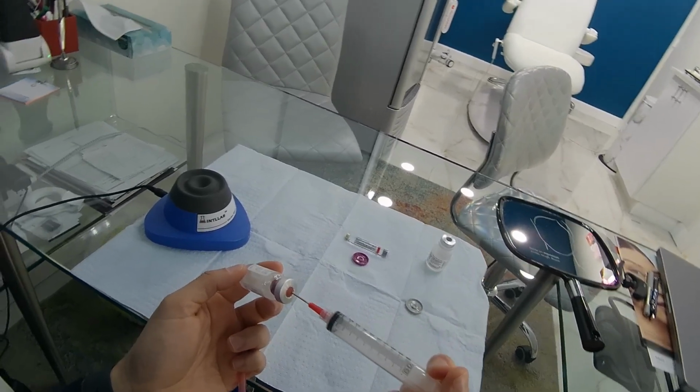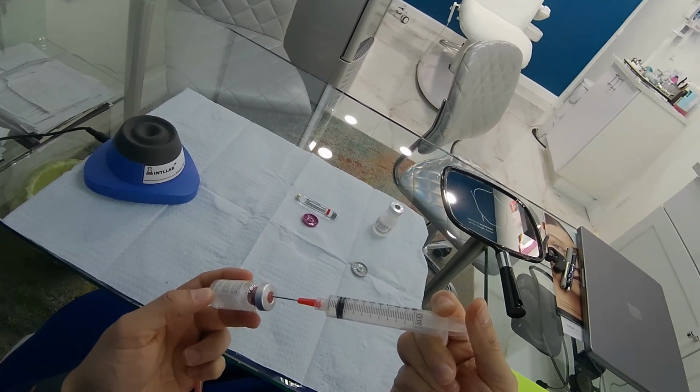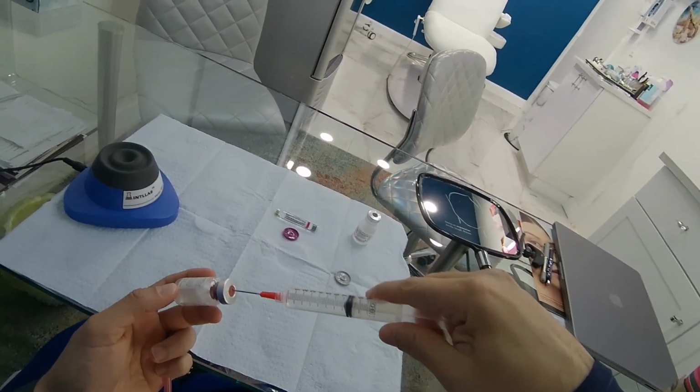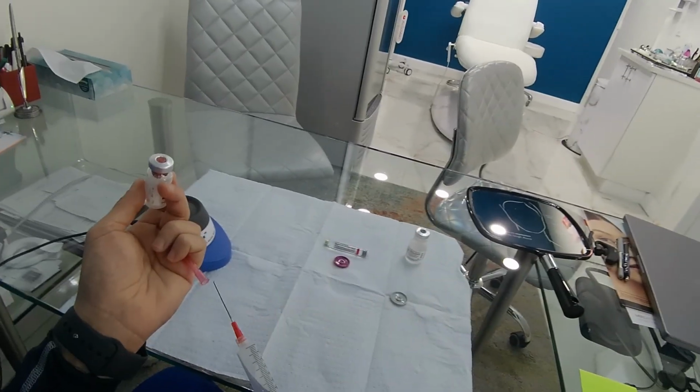push all the way. I get the tip of the needle up away from the fluid, and I'll just withdraw very gentle, slow, so that it doesn't draw any fluid back, and I'll try actually to empty all that air from inside.